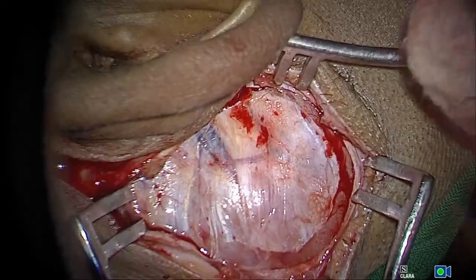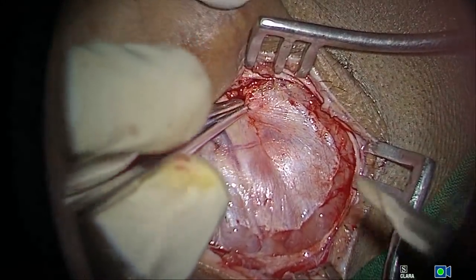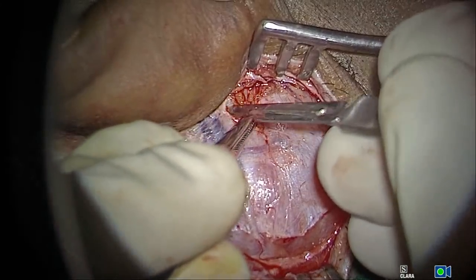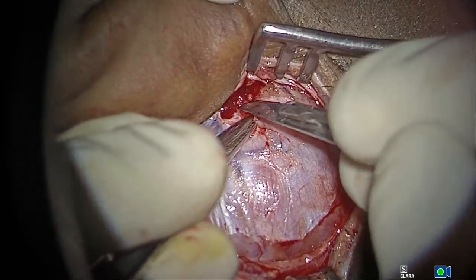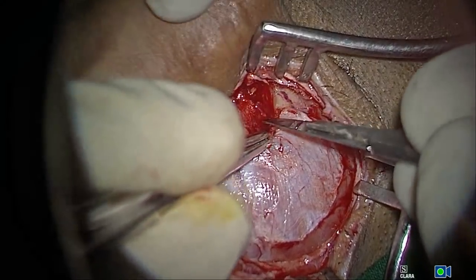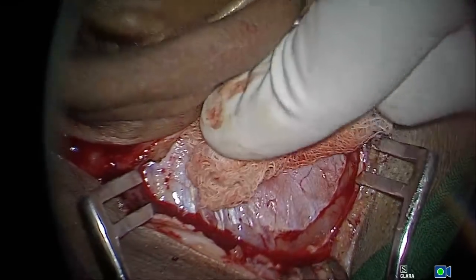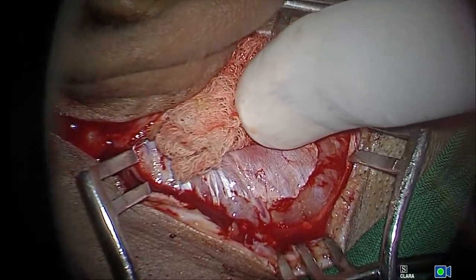So when you make the incision, you see how you have to make that incision. Bipolar or unipolar? Bipolar.